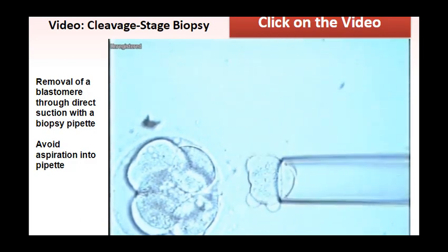Note that it is not necessary to aspirate the blastomere into the pipette. In fact, this should be avoided if possible, as it may increase the likelihood of blastomere lysis. The biopsied blastomere is then released into the embryo drop.